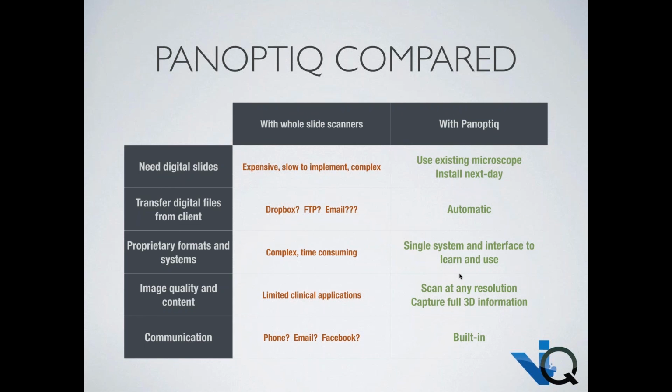So typically, our slides are on the order of 100 megabytes or so, 200 megabytes. But again, it does depend on the user. If you want to scan the entire slide at 40 times, you can do that, and we will obviously have larger files. But in typical clinical use of the system, the files are, let's say, 50 to 200 megabytes.